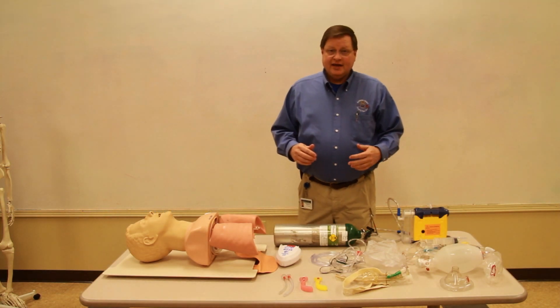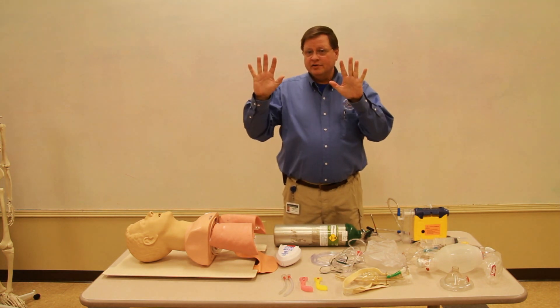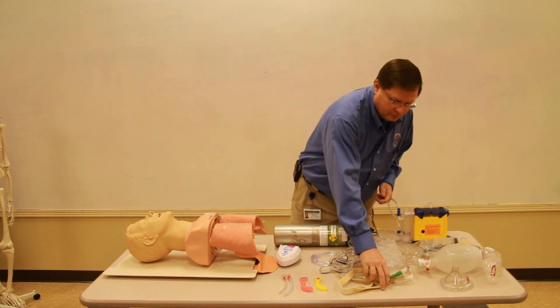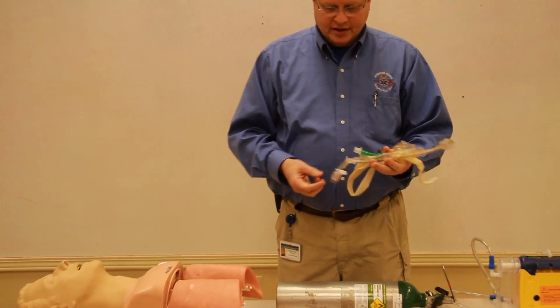My name is Randy White and I'm going to be demonstrating the pharyngeal tracheal lumen airway, or PTL. Always remember body substance isolation. The PTL is a double lumen airway.